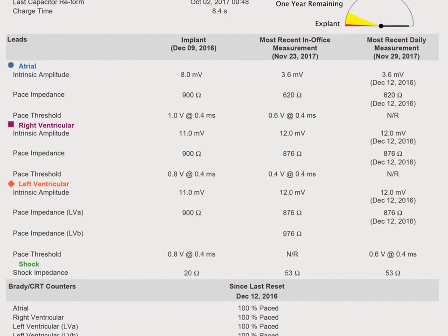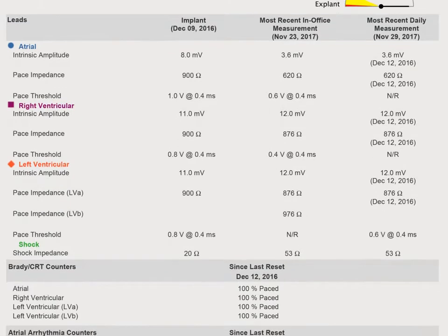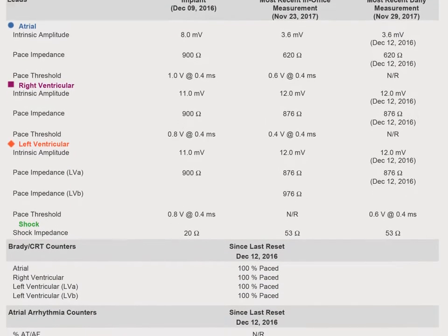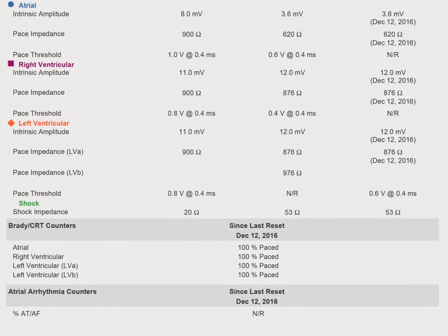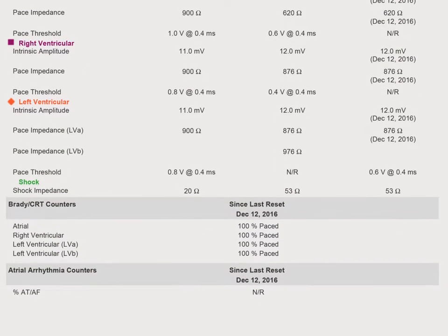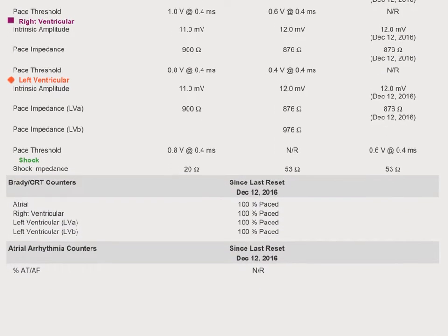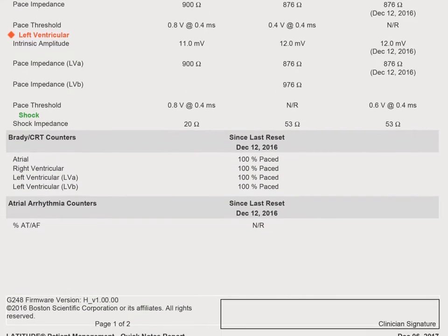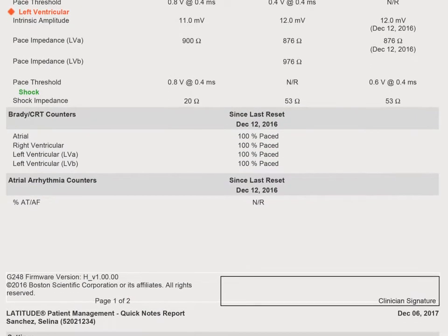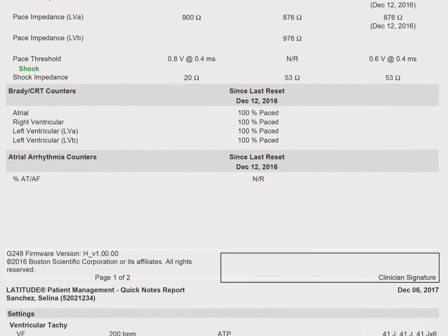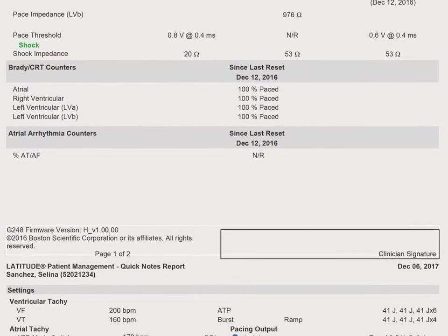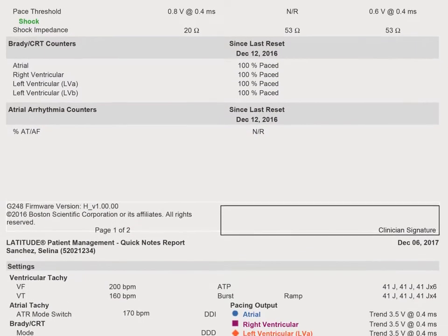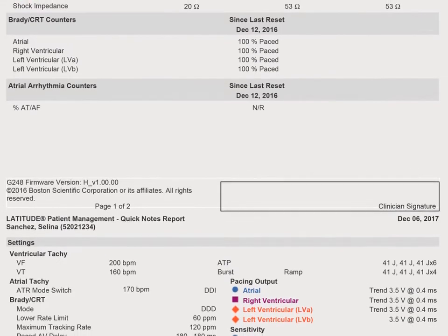This happens when scheduled follow-ups, patient-initiated interrogations, or device-based alerts occur. The data may also include other applicable reports as well, depending upon your EMR.